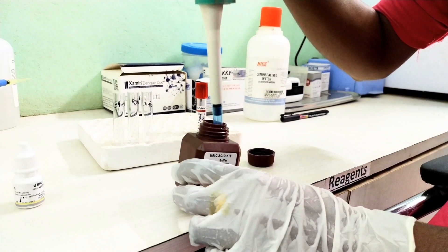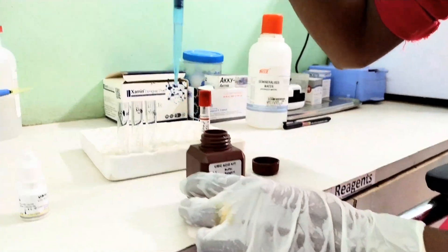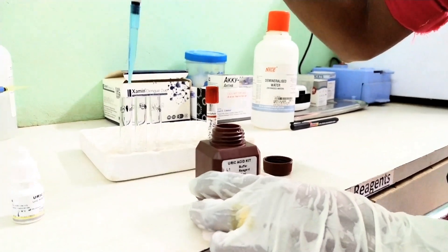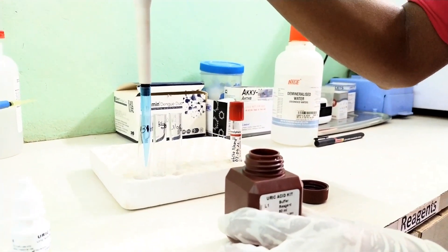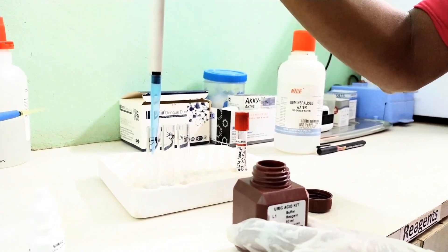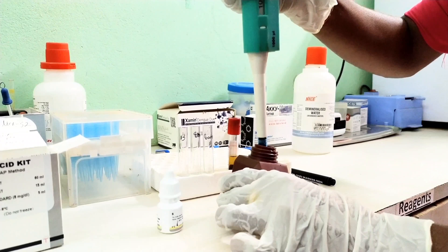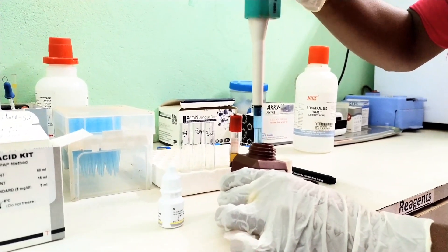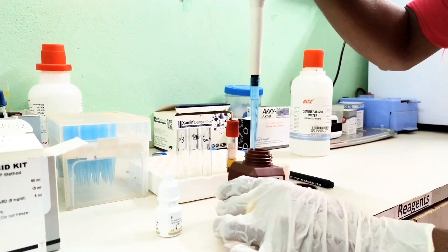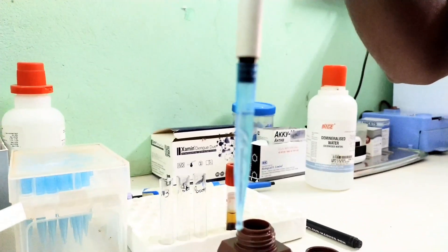Now, take 1000 µL uric acid reagent in each test tube. Firstly, I take it in the blank marked test tube — make sure there are no bubbles in pipetting. Secondly, I take reagent in the standard marked test tube, again ensuring no bubbles in pipetting.